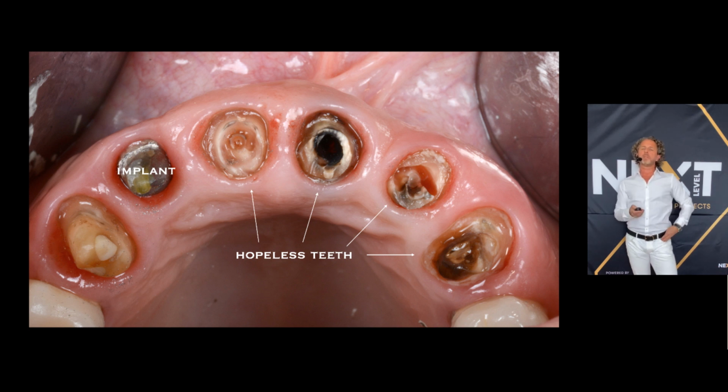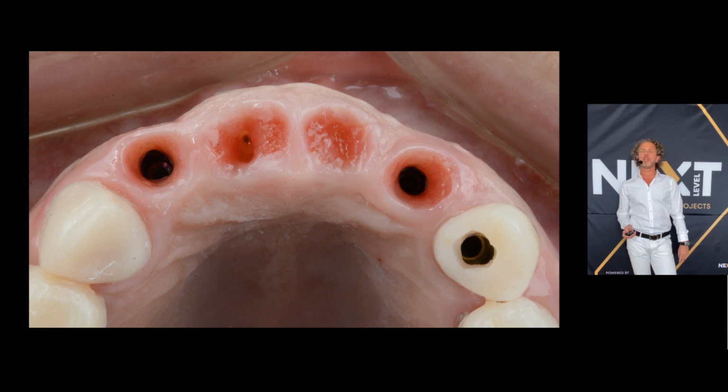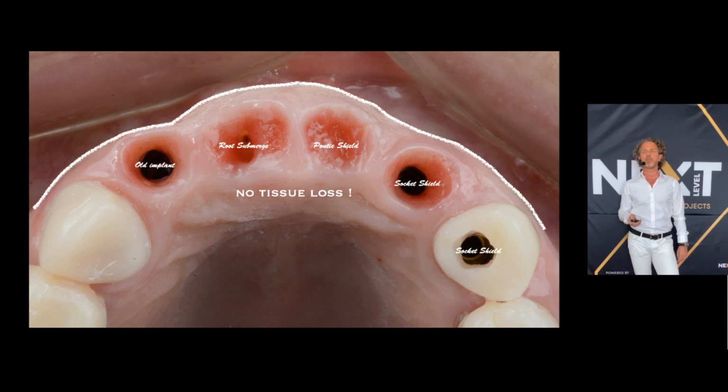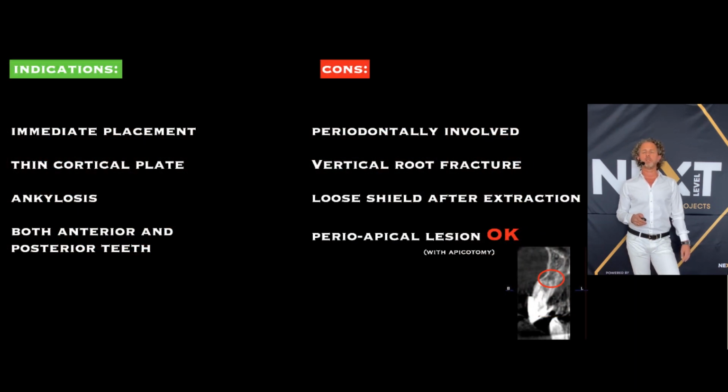Actually, this case is important and interesting because it shows all three elements of the partial extraction therapy. So these are hopeless teeth. We need multiple implant placement, but actually look at how it looks after 6 weeks. It's just 6 weeks. So we have an old implant on the right side. We had root submerged, a pontic shield, a socket shield, and another socket shield at the side of the canine. No tissue loss at all. It's amazing. In just 6 weeks, one operation, one surgery, one time. The least invasive procedure in implant dentistry.